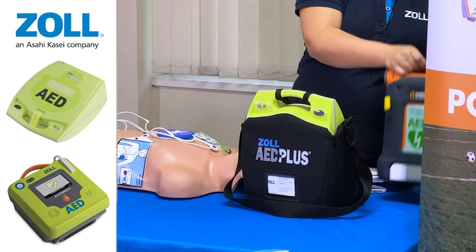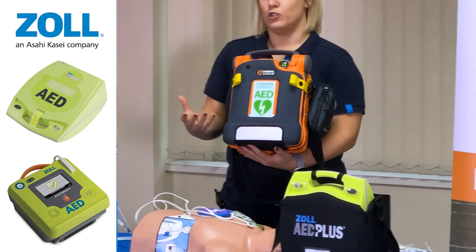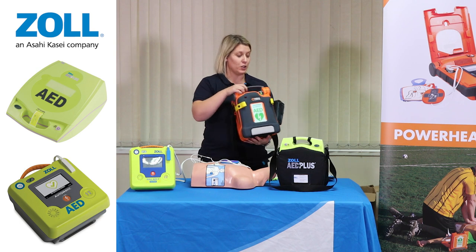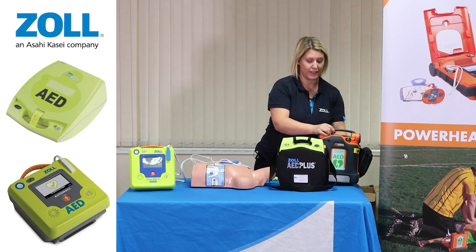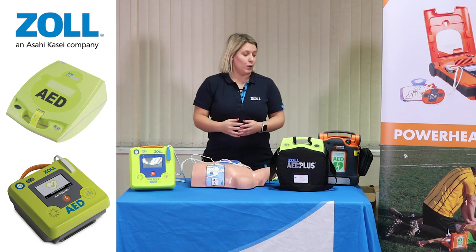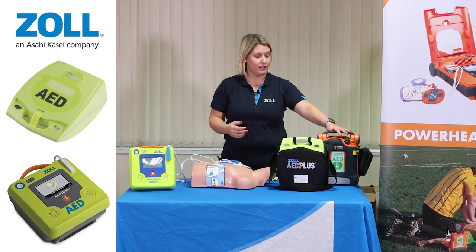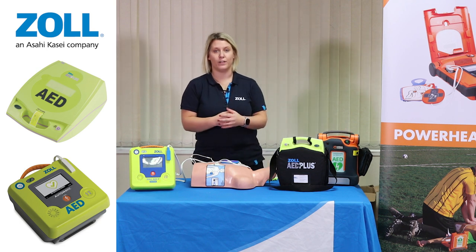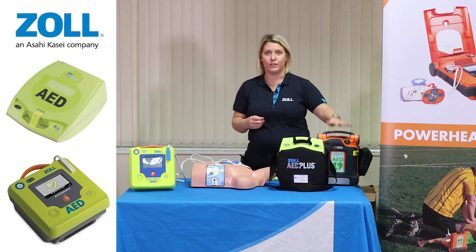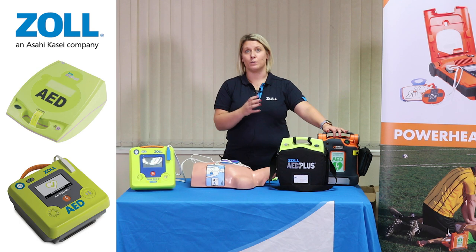In terms of the G5 device, which is this unit here, you're looking for a more construction or industrial style environment where you're looking for a device that's potentially going to be used in quite a muddy environment. The IP rating on it is a high IP rating of IP55, and importantly the device will conduct self-tests every day, every week and every month. The biggest point of that particular device is being rescue ready.